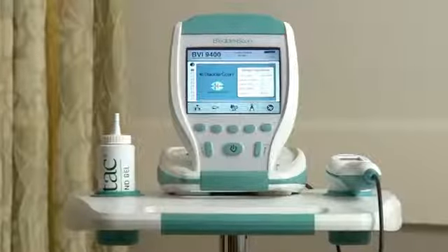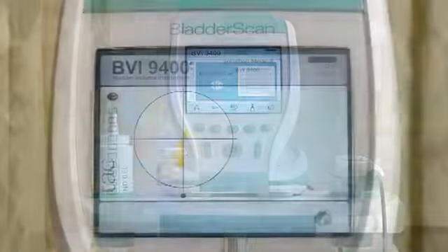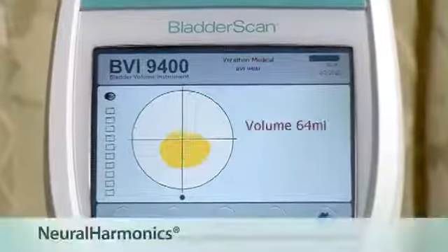Today I want to introduce the bladder scan BVI9400, a bladder volume instrument with neuroharmonics technology. The bladder scan is a key instrument in acute care. It provides medical and nursing staff with accurate bladder volume without causing patient-related complications like pain and infection from unnecessary catheterizations.